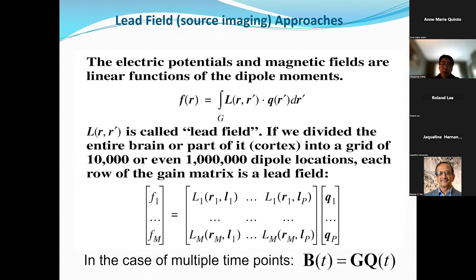That's, if you know the location of one specific dipole, how to calculate the forward calculation of the MEG field at each sensor location. That's exactly the forward calculation, right? That can be done beforehand. So I can pre-calculate this big matrix because I know the location, and I know the sensor orientation and sensor location. I pre-calculate this giant matrix. And then my question is, for given measurements at a specific time, on the 306 measurements F1 to FM, how do I calculate dipole strengths Q1 through QP?